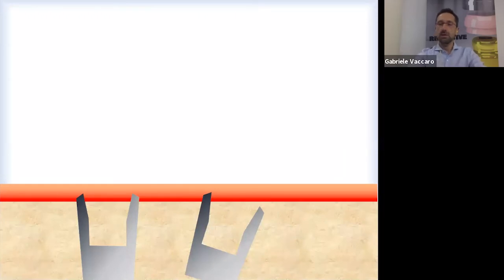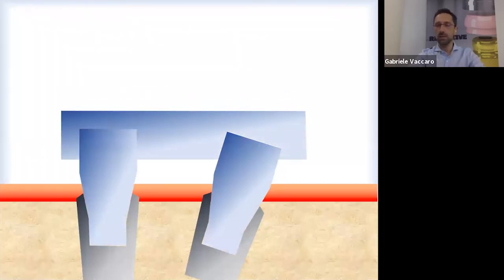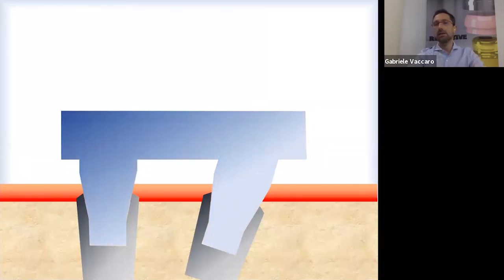Then I try to take the impression with an engaging transfer. And I put my engaging transfer. When I say engaging transfer, I mean a transfer that gets a strong connection with the internal hexagon or Morse taper connection of the implant. I put my transfers, then I fix them together with resin or with the impression paste material. And once it's hardened, it all becomes one single piece.